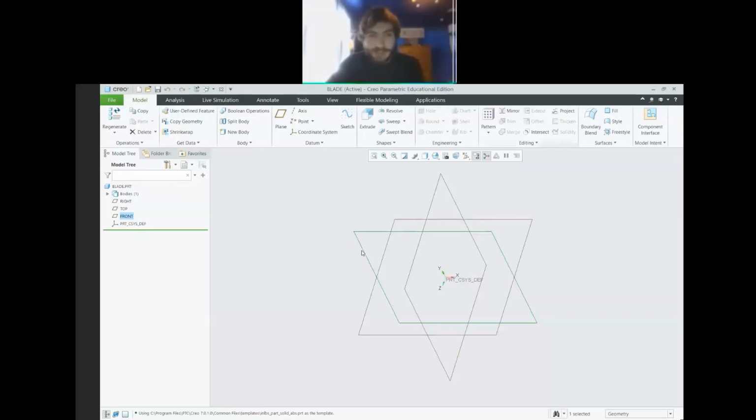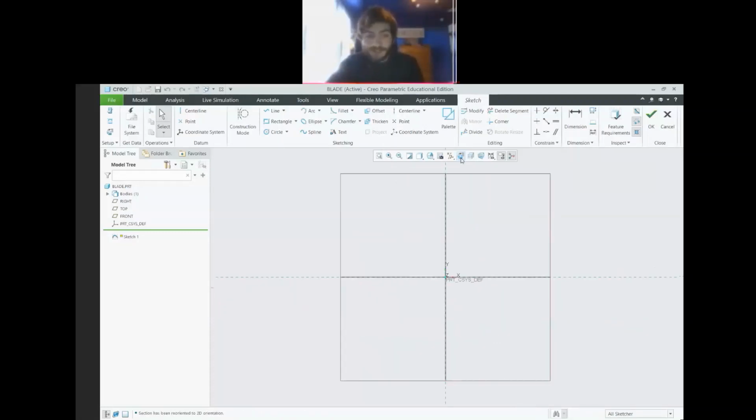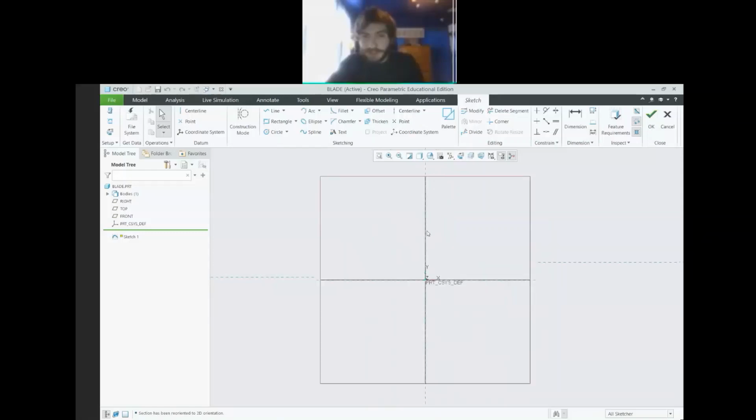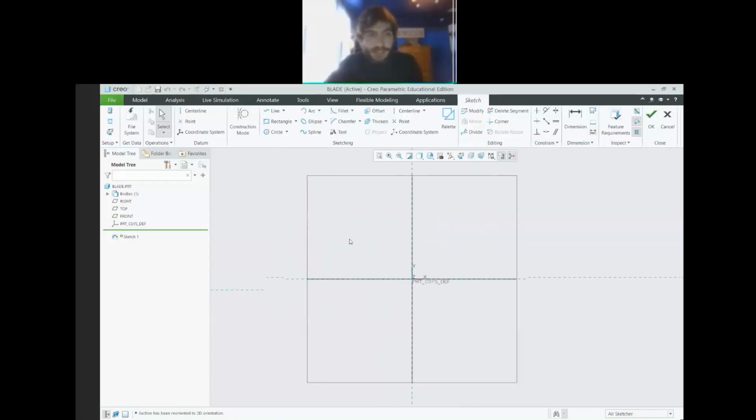So the first way, we're going to go on that front plane. We'll pre-select it and press either Sketch up here at the top, or when we select it, there's a little pop-up window where we can press Sketch. Then on this mini toolbar, we go to sketch view so we can see a straight-on view and sketch in 2D here. To drag and pan around, hold shift and click the middle mouse button, so you can shift your window around. We're going to create that J shape. It'll be super rough at first, and then we can add dimensions to it later.